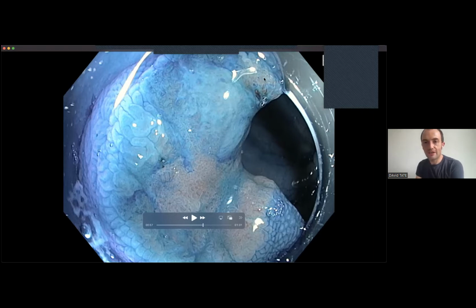So what you have here is a demarcated area, which I'm drawing around right now. Then you have the normal polyp on the outside, which you can see is beautifully regular around the outside. Then you have this part of the demarcated area, which still has some structure, but it's not fully maintained. So irregularly irregular or regularly irregular, whatever you want to call it. And here you have total loss of the structure, and it's irregularly irregular.